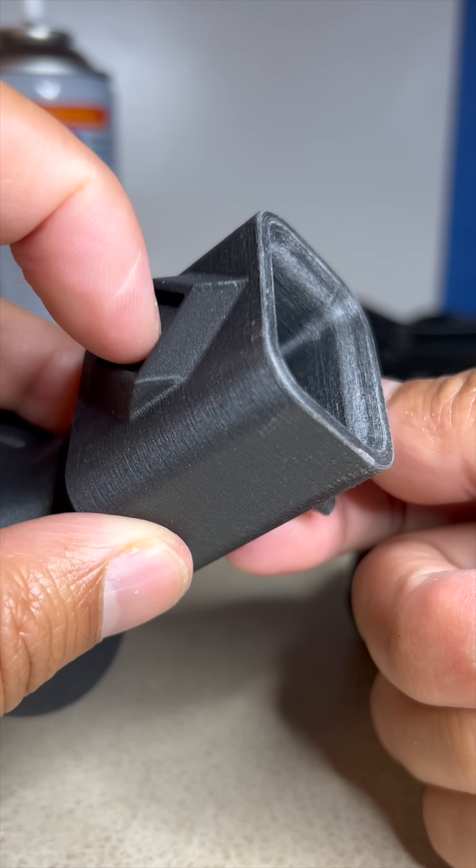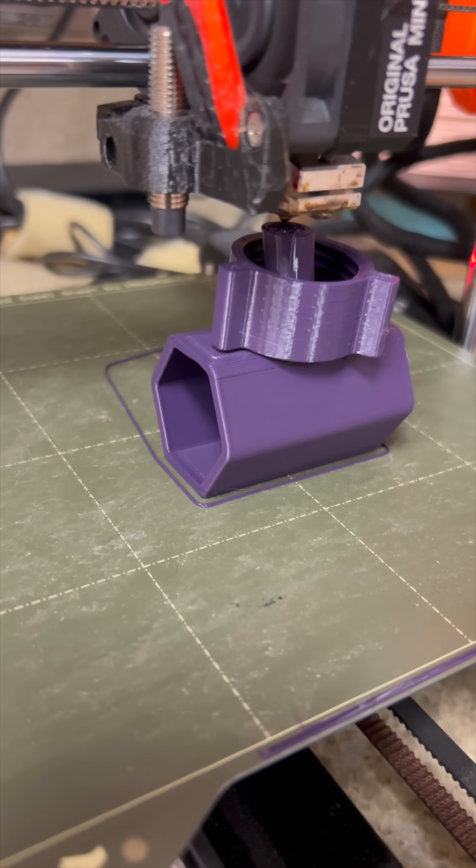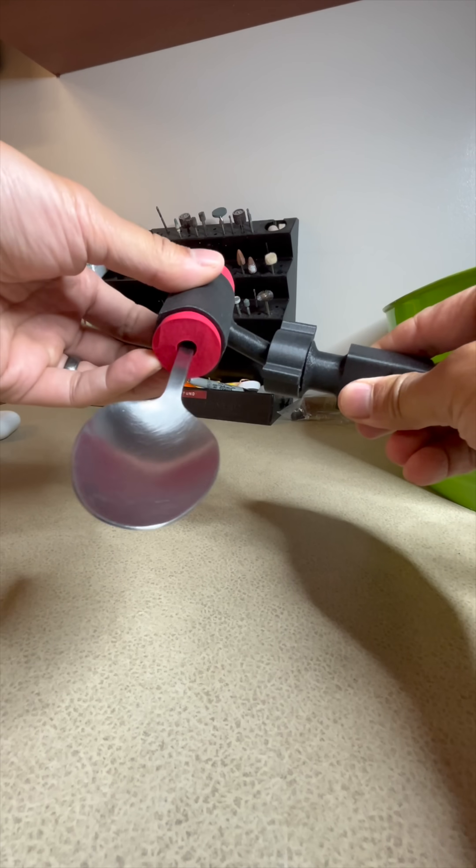This tool is sort of a pre-prosthetic. The base has a pin that uses magnets to hold it open or closed. The feeding tool uses a ball and socket joint to adjust the angle to eat.